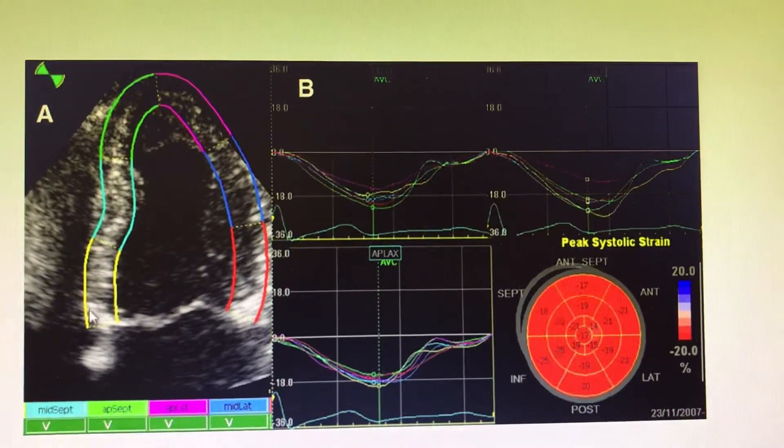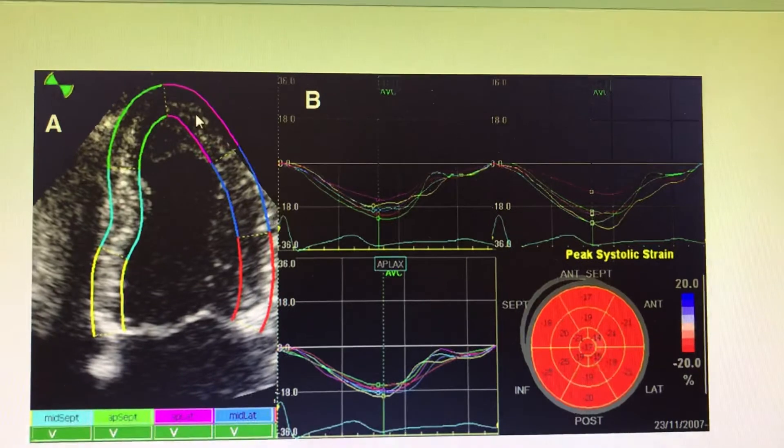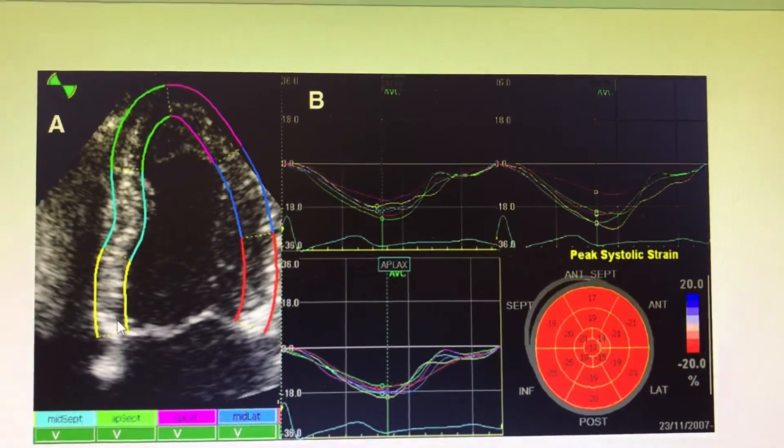Usually the apical 4-chamber view is taken and the normal longitudinal global strain is measured. The mean is taken, similar to how mean ejection fraction is calculated.